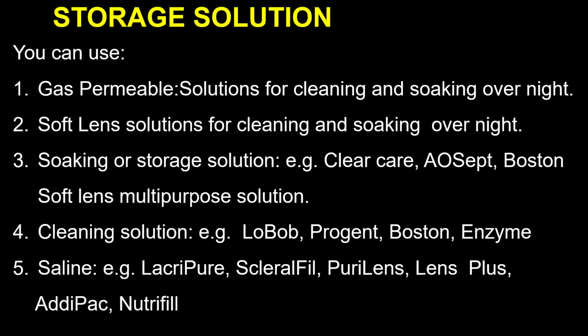Okay, a quick one. I wanted to know, you didn't make mention of pterygium. Pterygium and pinguecula are something we see every day in our clinics. Are they good candidates for scleral contact lens fitting? Interesting question you've asked, Dr. Karachi. Interesting question. So the truth is that you can actually fit scleral contact lenses on pterygium.